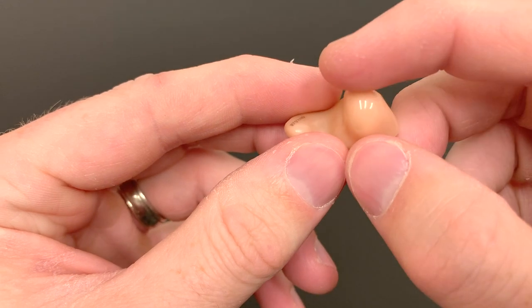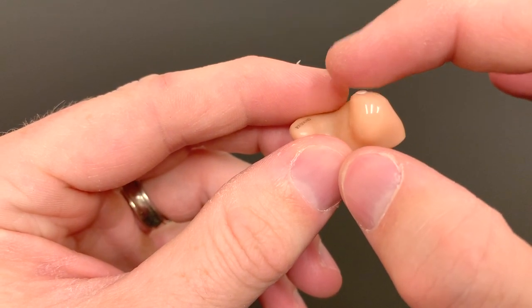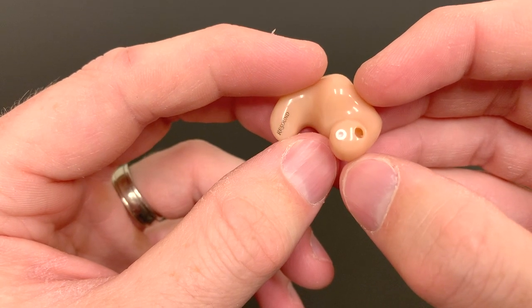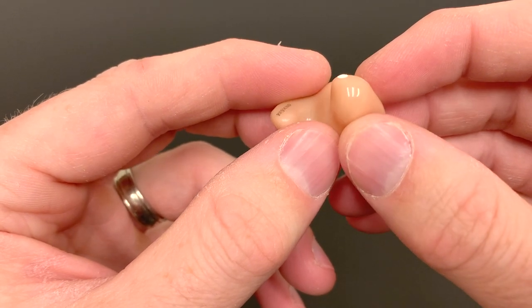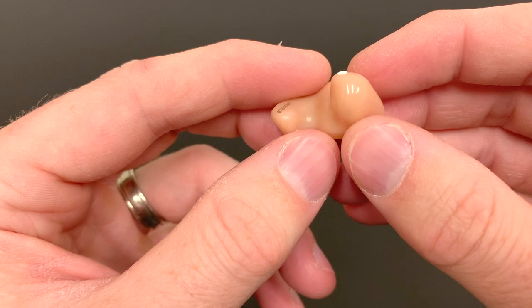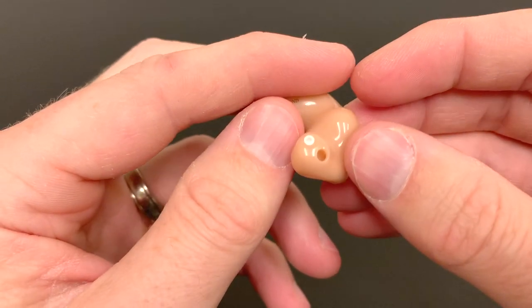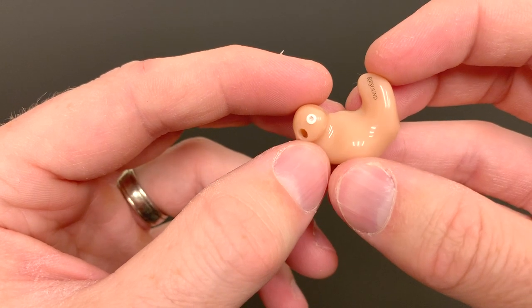On the end of some of these custom hearing aids, you may see a rubber tube extending out of it. That's called a tube extender, and that's used again to help with some of the acoustics or the way that the hearing aid fits in the person's ear. So that's the anatomy of the custom hearing aid.